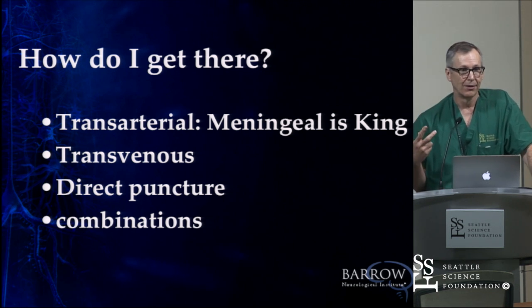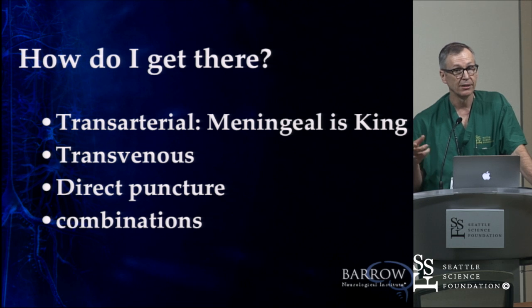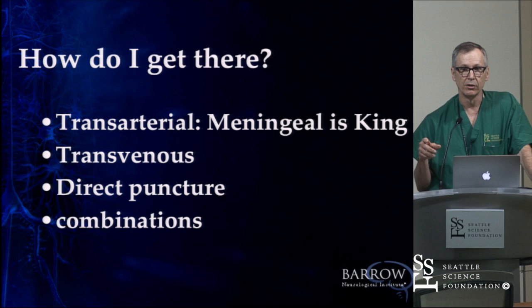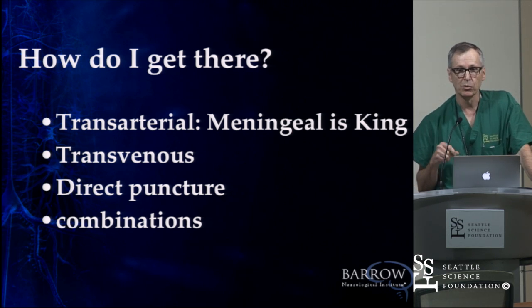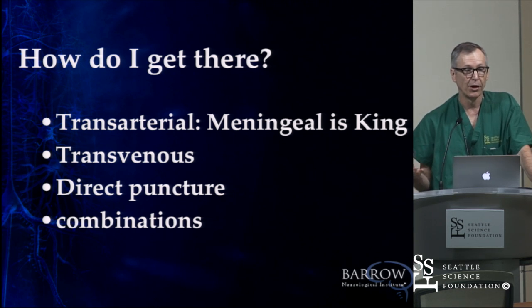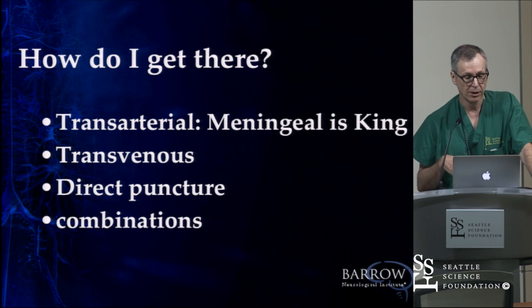Endovascularly, the middle meningeal. I'm always looking for the middle meningeal artery because it's a nice, straight, easy shot, easy to get into. It's safe. The collaterals from it are somewhat more consistent, manageable, and avoidable, particularly if you're looking at fistulas that are located back in the transverse sinus around the tentorium. It's all sort of free lunch back there. There's really very little you can hurt.